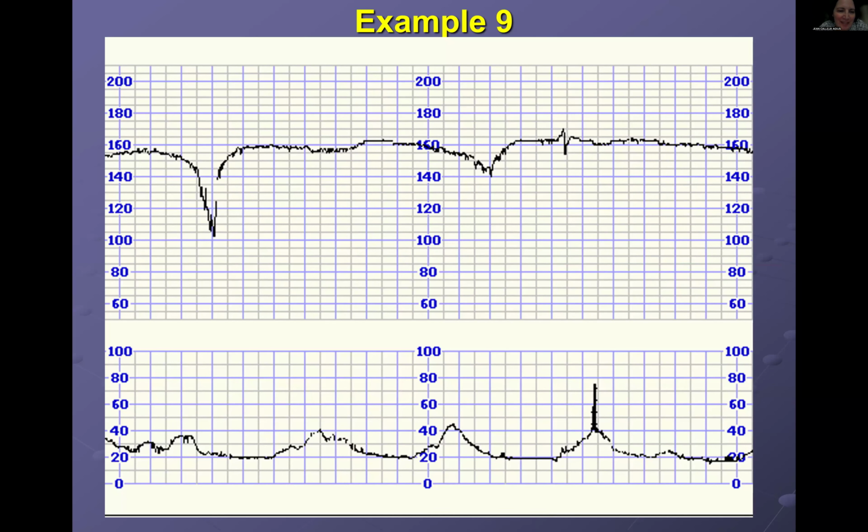So let's start with contractions. Remember, she's 31 weeks and her presenting complaint was reduced fetal movements. Does she have any contractions? Yes, Prof. There are. I can count between two to three contractions. You're right. So even though she's still 31 weeks, she already has contractions. Very good. So what about the baseline rate? And remember, she's 31 weeks.